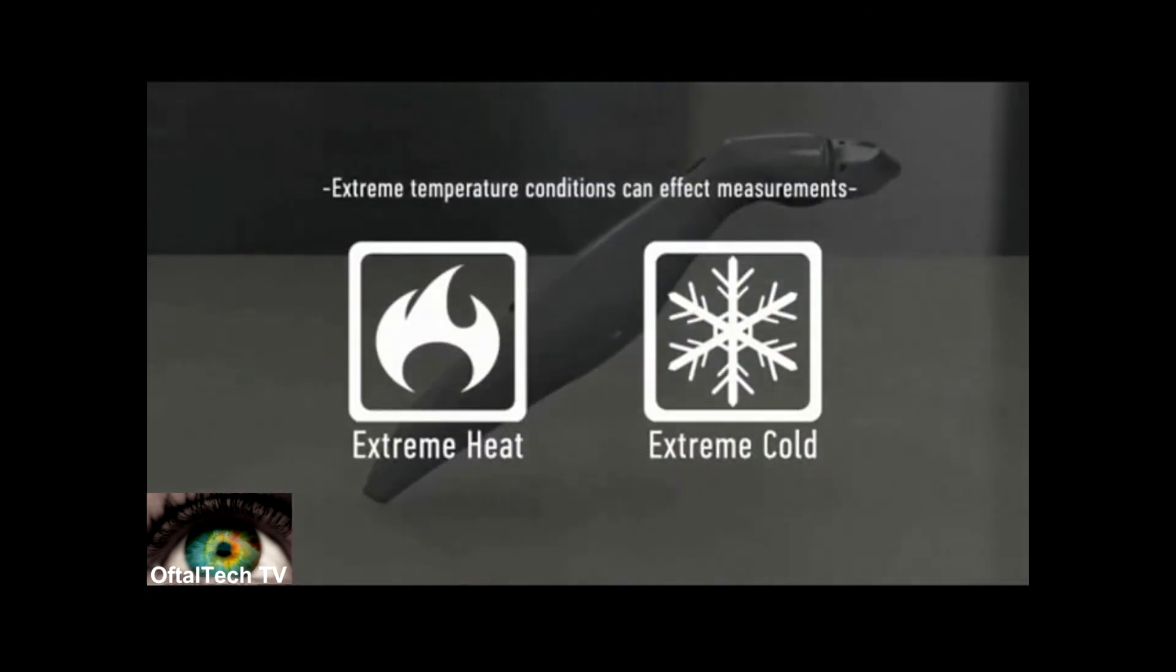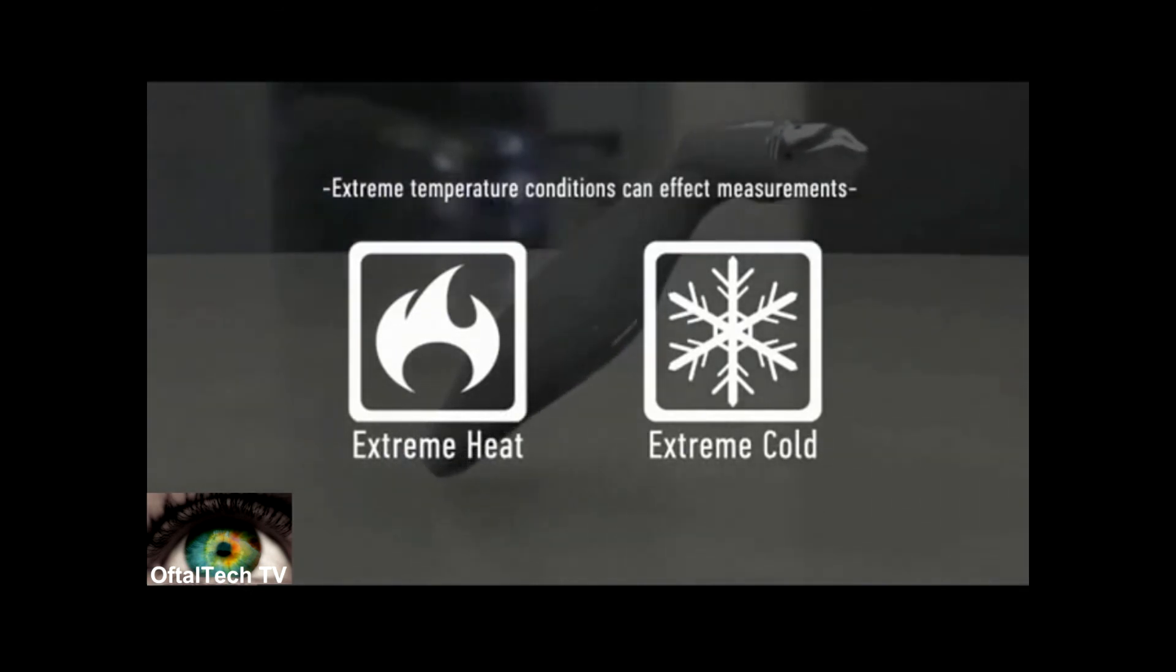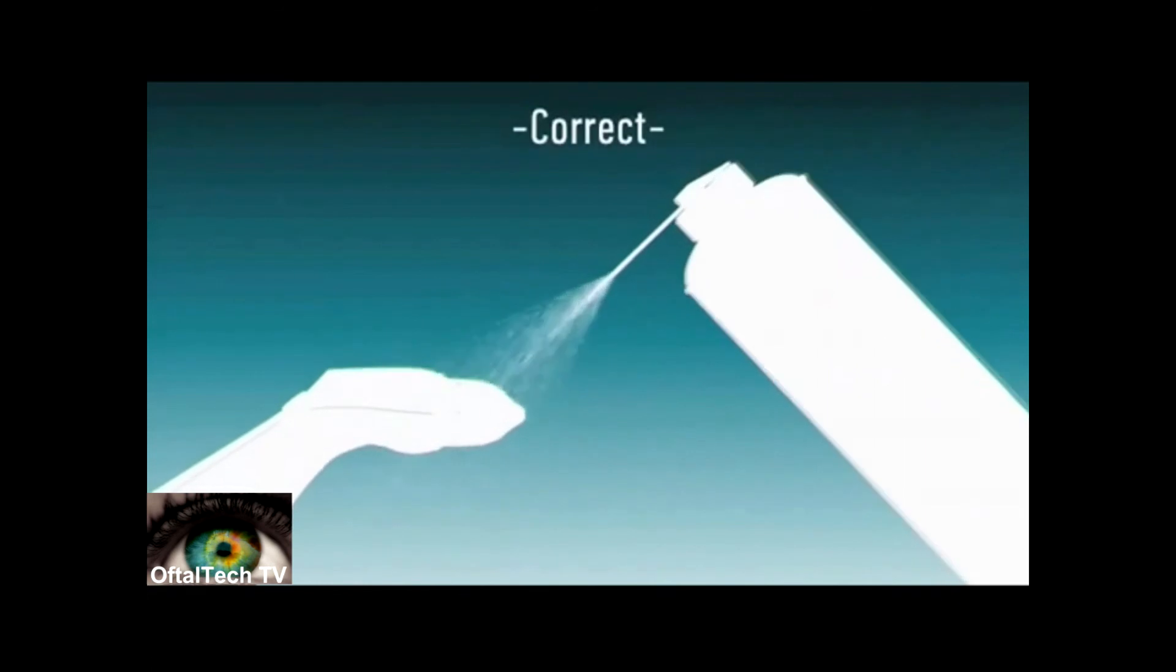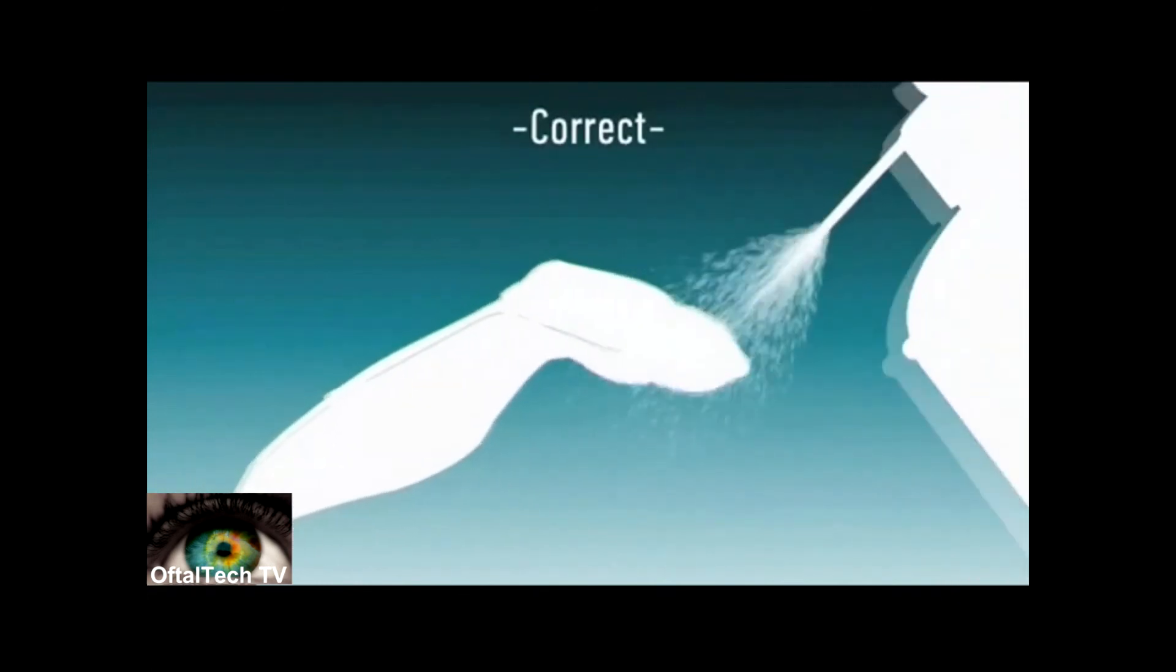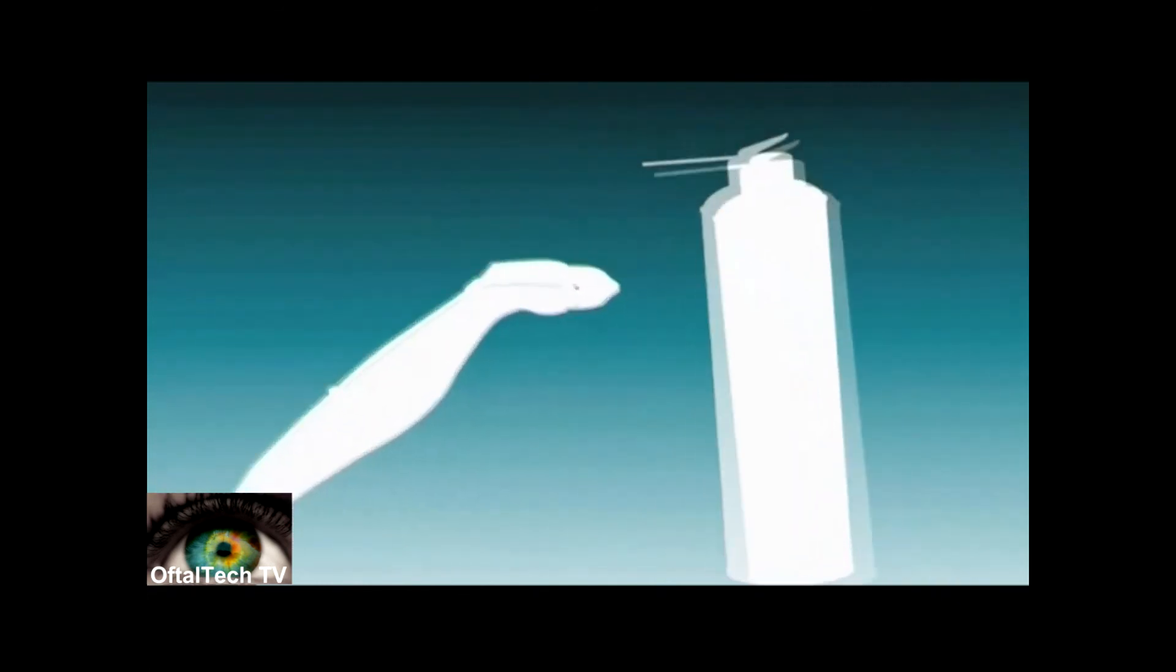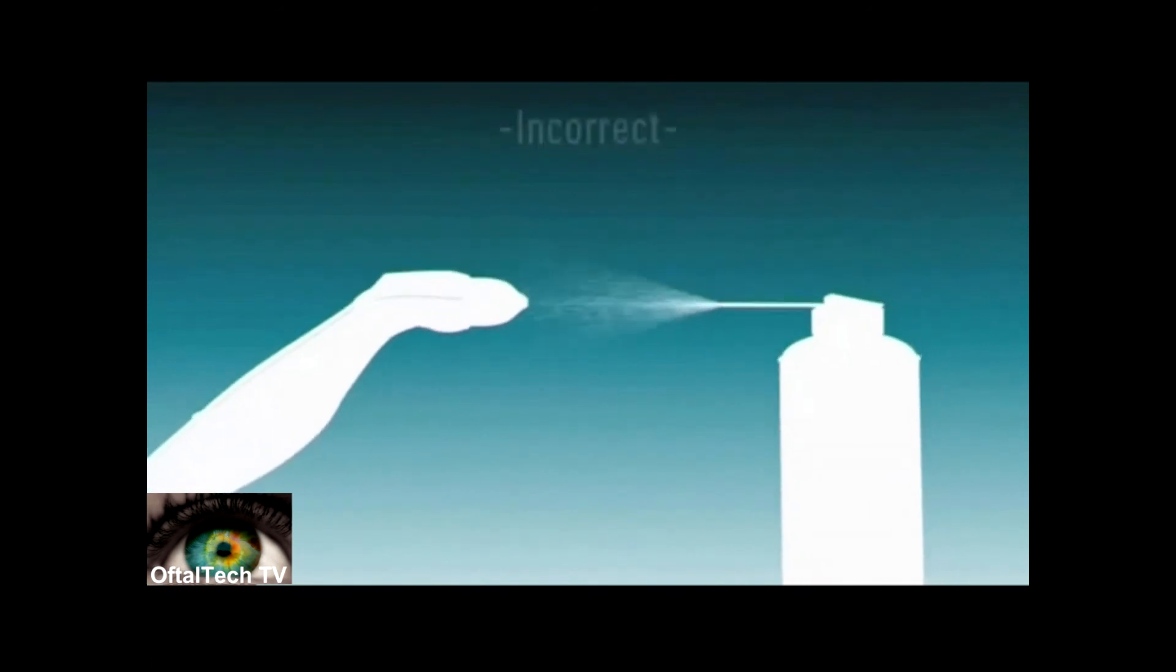Compressed air can be used to clean the tip of your AccuPen. Shoot the can on an angle at the transducer tip. Do not shoot the compressed air directly into the transducer. Do not hold the can upside down because liquid can enter the transducer tip.